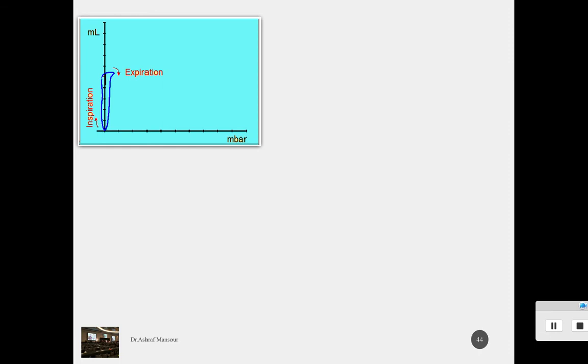And sometimes you find this picture the same, but the loop is coming here, like that. The baby is so tachypneic that the ventilator cannot drive any pressure. And if you go to the measurement, you will find that the PIP of the baby is equal to 7. Why are you giving the baby 20/6, but the measured PIP is only 7? So the baby looks like he is breathing by his own effort against only the PEEP or the CPAP.